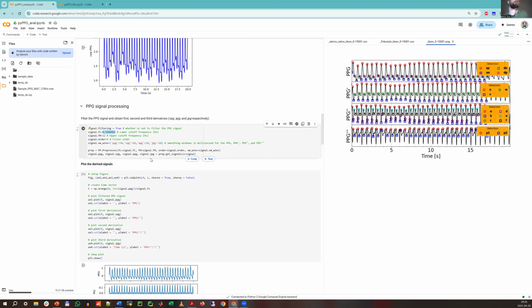But keep in mind that with the IIR filter, there can be some disturbance in your signal which is not related to the signal but to the filter itself. With this modification, I could achieve a significant acceleration over the previous implementation, and that's why it was very important.